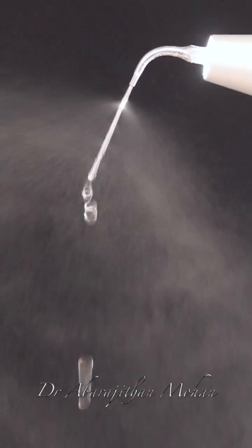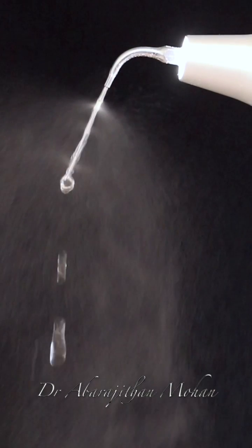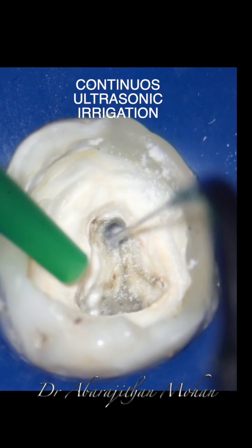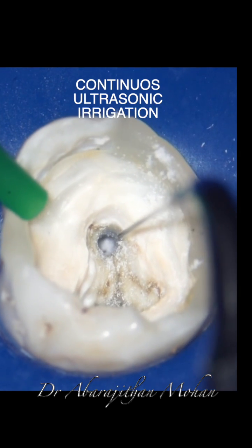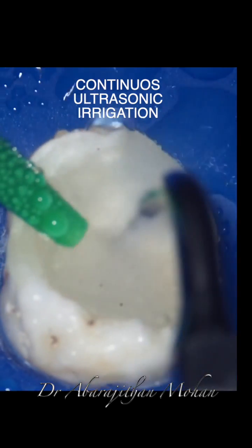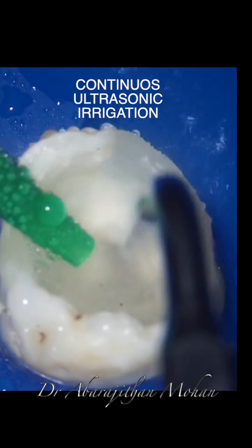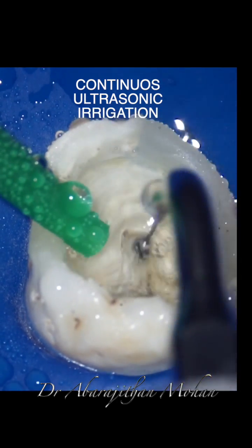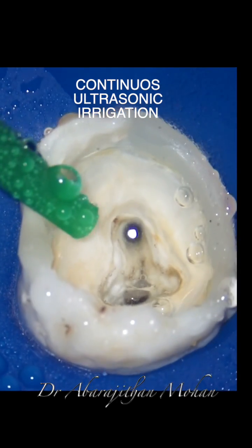Here you can see me demonstrating the efficiency of this through my macro lens. This tip can be used for continuous ultrasonic irrigation — after your rotary instrumentation there is a lot of gross debris in the canal, which can be removed by using it in continuous irrigation mode with just saline or water from the scaler to debride the canal.